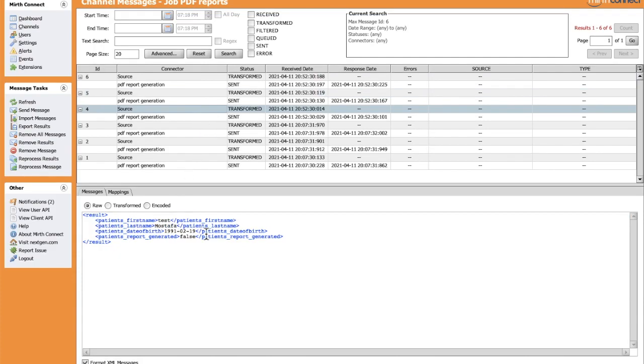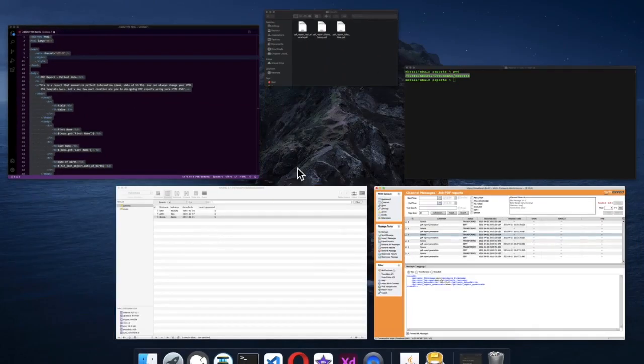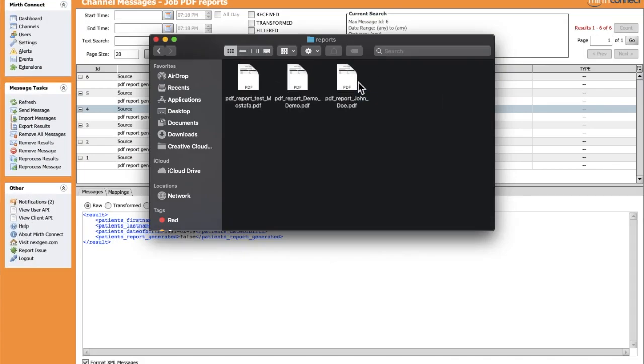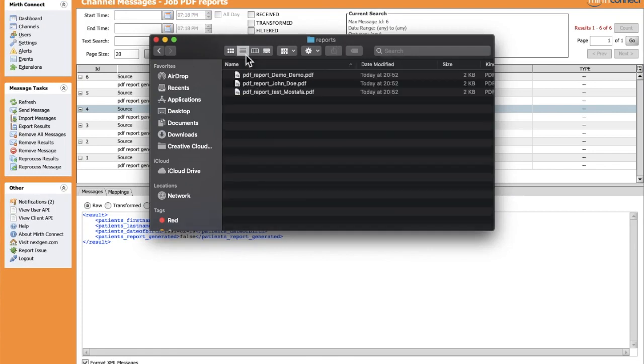Let's check the PDF reports for each patient in the reports folder. We have our three PDF reports with the first name, last name, as we concatenated for the name of the file.